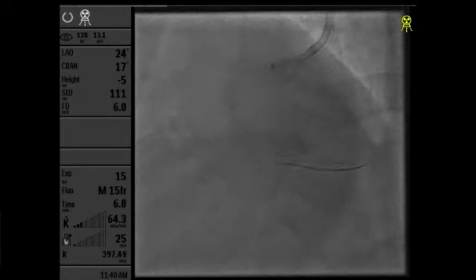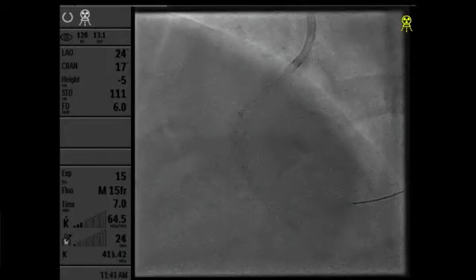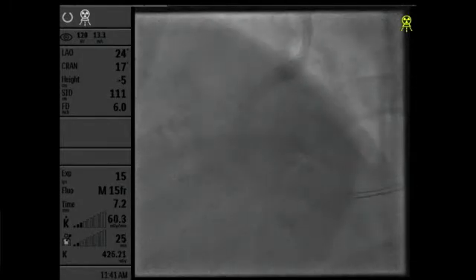I'm going to just raise my hand and say a balloon at the very beginning. I want to know what we end up with. We could dilate it first. We've got a telescope, we've got a Shockwave balloon, we've got a non-compliant balloon. That's why I would not have gone with the Shockwave at the beginning. He's got it now. Why don't you bring the telescope all the way down? Just a tiny bit. Just do a gentle inflation, go up to nominal. Gentle inflation at the lesion and then pull it in.